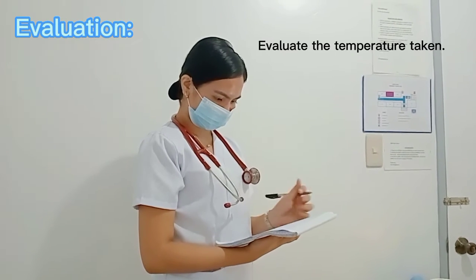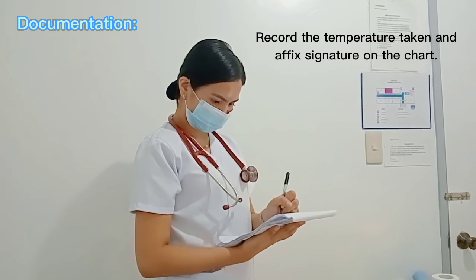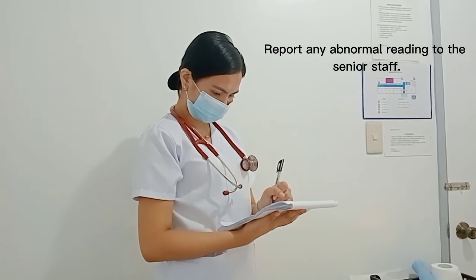For evaluation, evaluate the temperature taken. And for the documentation, record the temperature taken and affix signature on the chart, and report any abnormal reading to the senior staff.